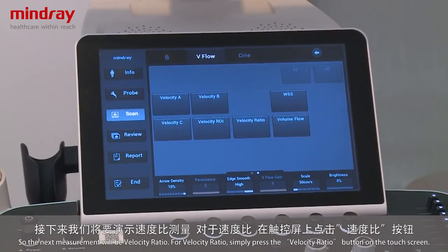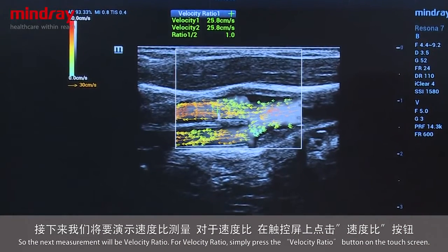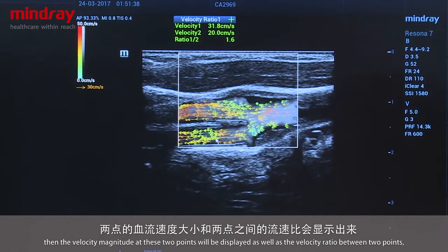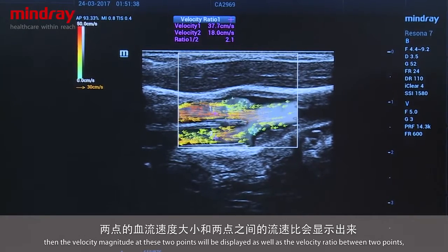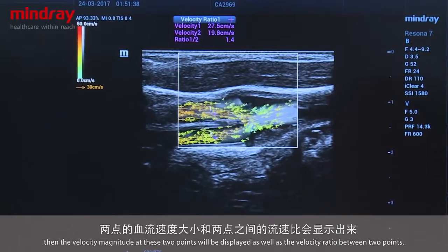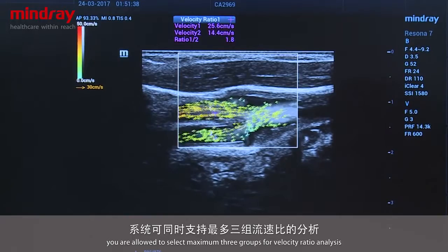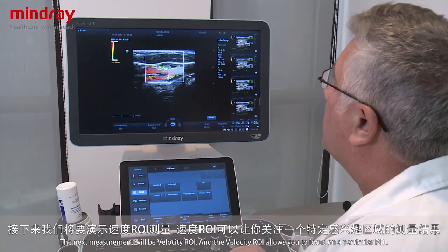For velocity ratio, press the velocity ratio button on the touch screen and select two specific points in either of the vessel lumens or on the velocity curve. The velocity magnitude of both points will be displayed, along with the velocity ratio between them. You are allowed to select a maximum of three groups for velocity ratio analysis.